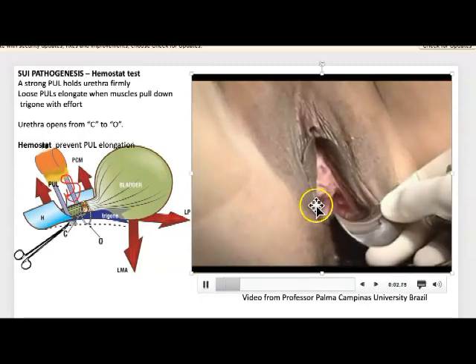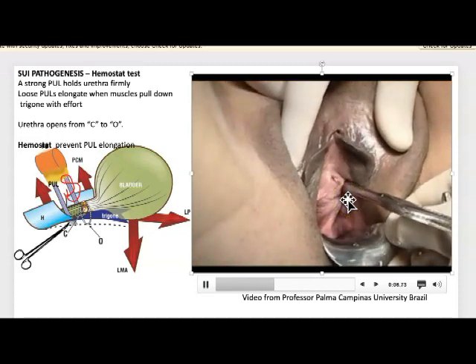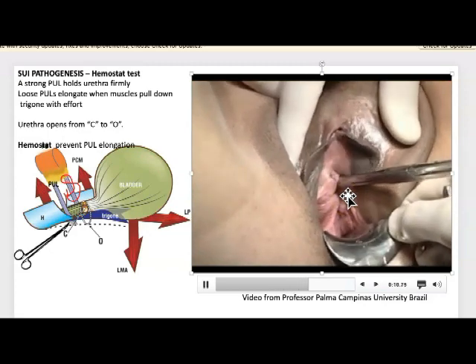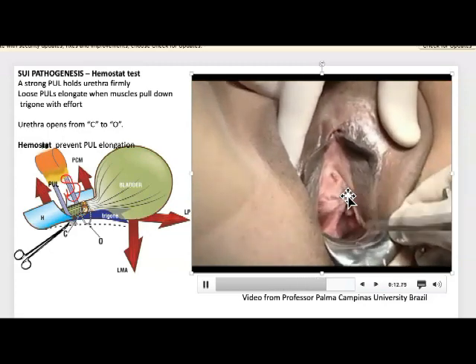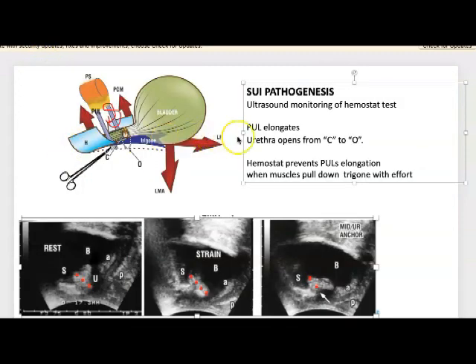The patient is coughing now. The hemostat goes immediately behind the symphysis — there it goes, immediately behind. Now he's pushing it behind, and that's holding up the pubourethral ligament. The patient is coughing and not losing urine. Now this is an ultrasound monitoring of the hemostat test.